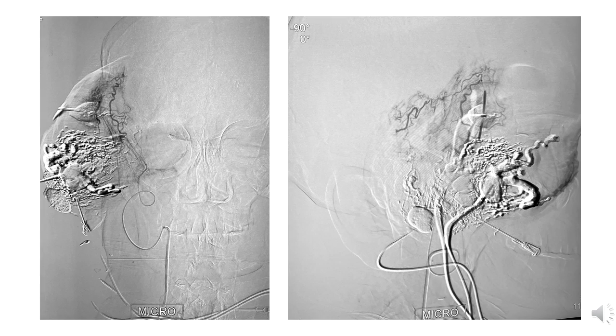We have to be careful what size of the particles we are embolizing, so that it should not reflux into the dangerous anastomosis, it should not cause skin necrosis, it should not cause nerve palsy, etc. We can learn a lot about that. But usually in these situations, if you are just seeing the tumor enhancement, you know that the tumor is going to be excised, and along with it, the skin immediately over the tumor is also going to be excised. We just want to be sure that we are not going into the normal skin and the normal structures. That's all.